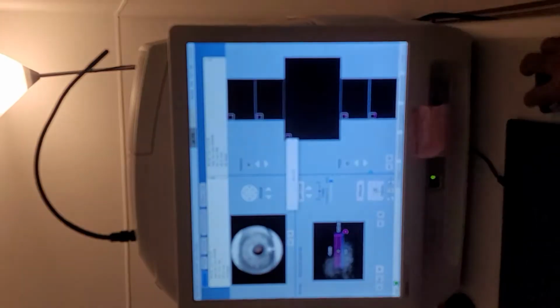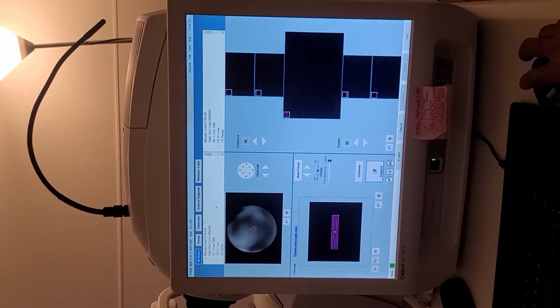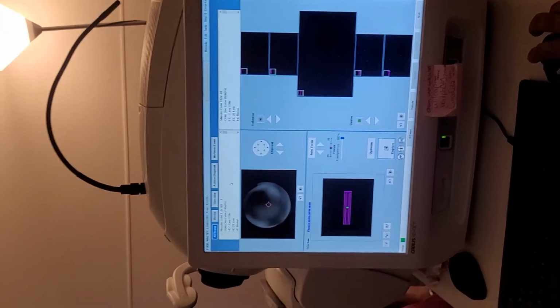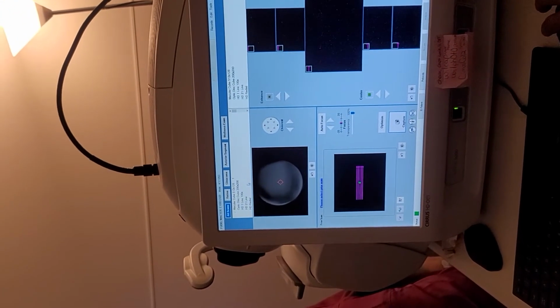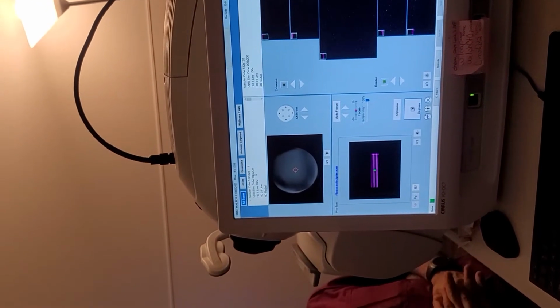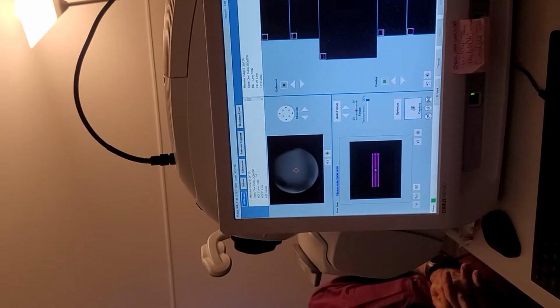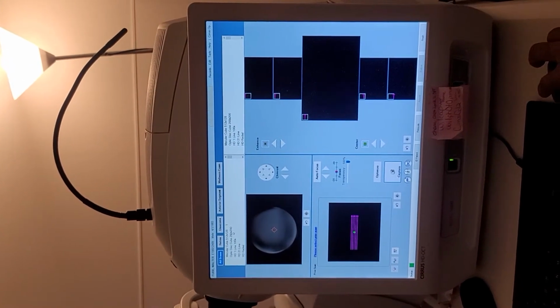Save. So always remember, on the last screen that we were just at, if you didn't think it was good, then retry it. Or you can save it and look at it because you don't have to choose that one. You'll have a couple of different options. And you're going to have a difficult patient that you're not going to be able to get, right?